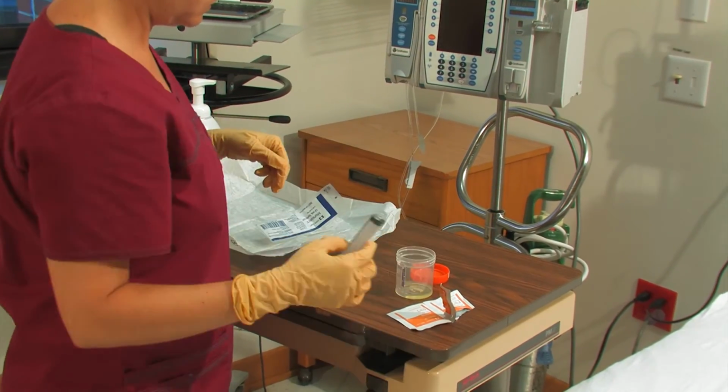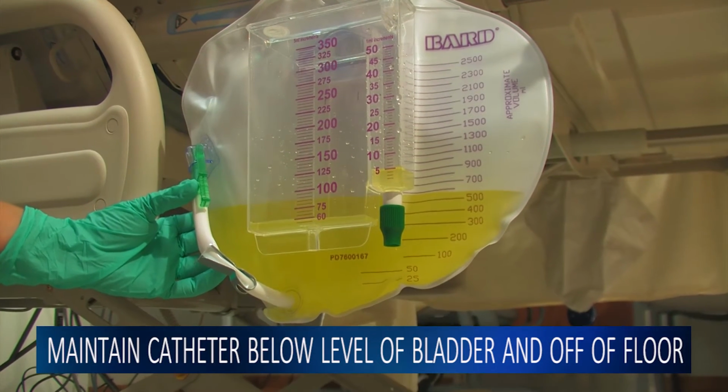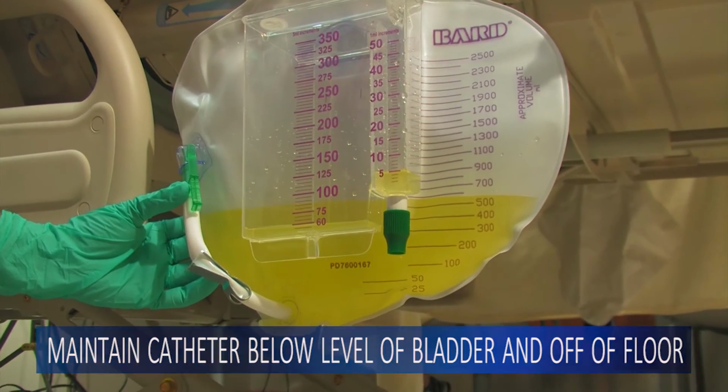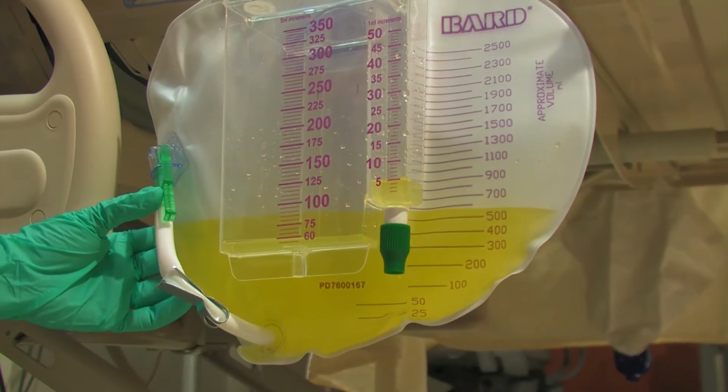Keep the urine collection bag below the level of the bladder. Keep the bag and tubing off the floor. Do not put the urine collection bag in the bed or on the patient's lap during transport.